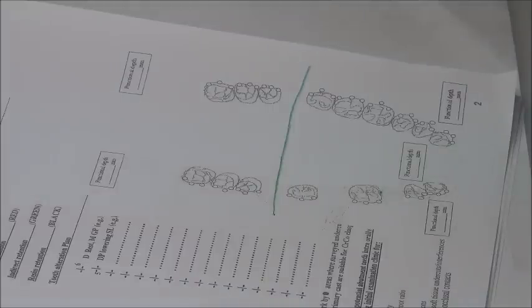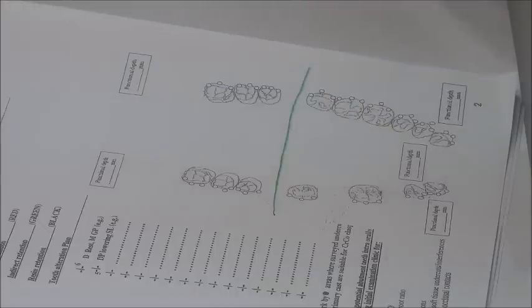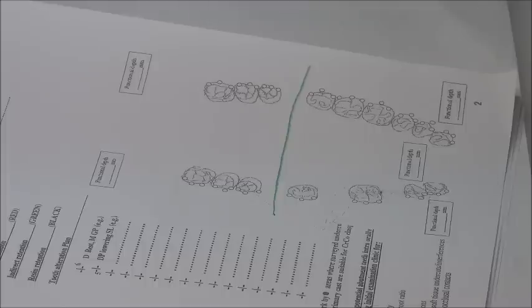Okay, I have to extend my design. Usually the last rest here should have a last rest here, opposite to it, on the same teeth on the other side. Okay, we call this cross arch stabilization. So we stabilize the arch in terms of support. We're sending support to the other side. So this is one. If we have support on one side, we should have support on the other side. What else am I extending?